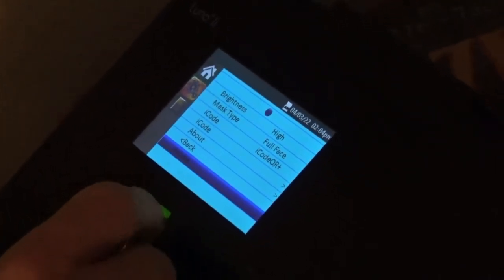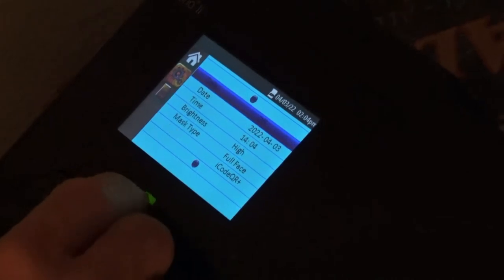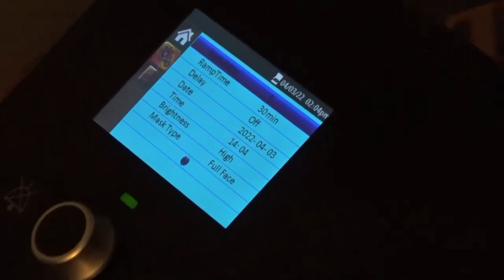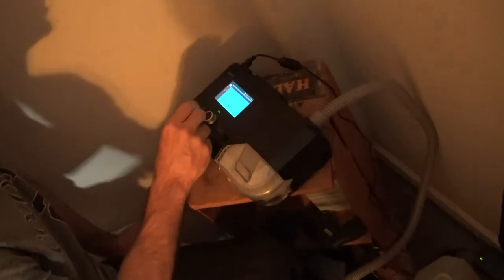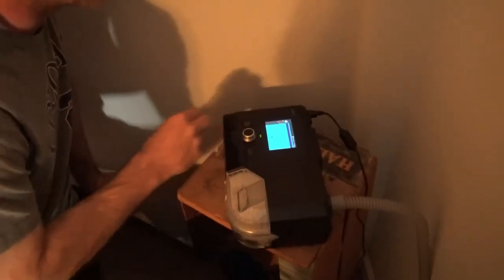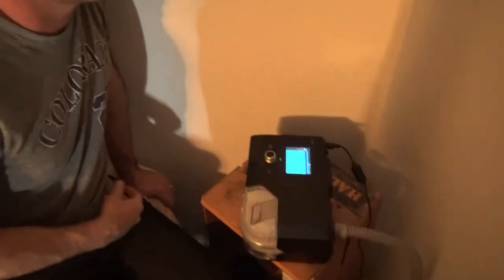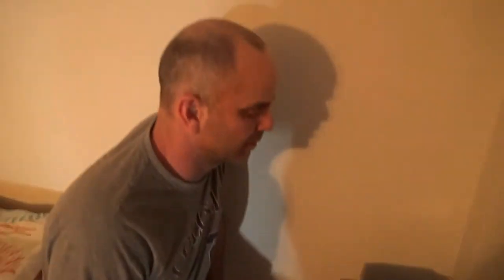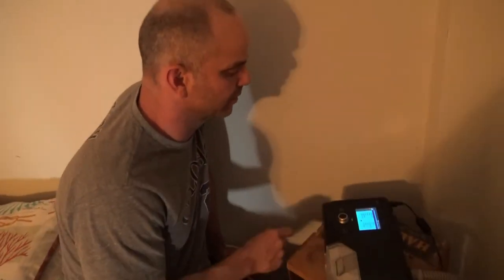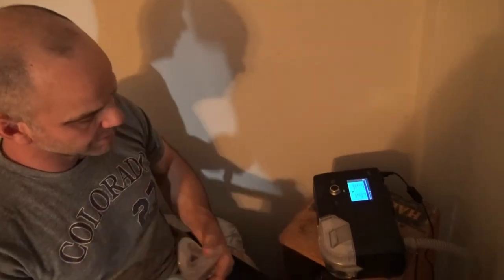You can adjust date, time, brightness, mask type. It even lets you adjust the mask type, and it keeps going down to some kind of codes. The only thing I don't like about this so far is you have to take the memory card out each month to get your printout of your data to show that you're using it. I have a CDL, so I have to take it in to get my printout.